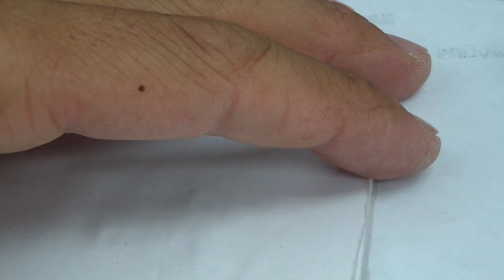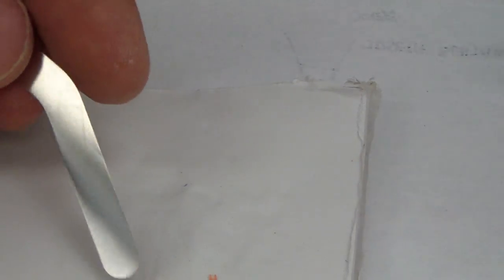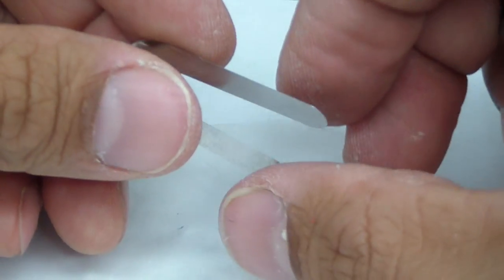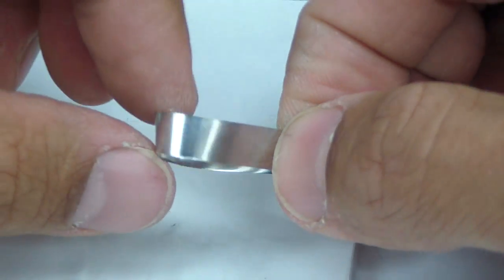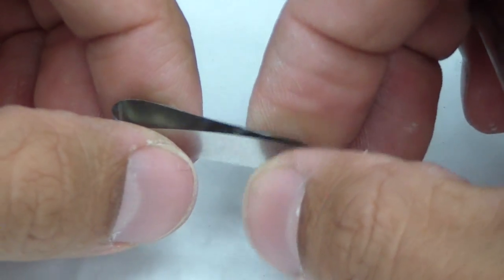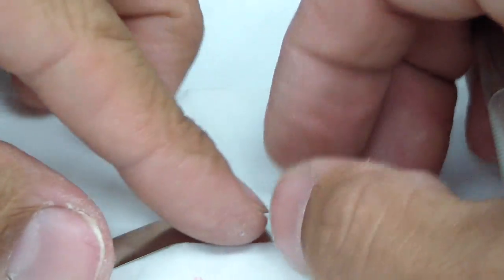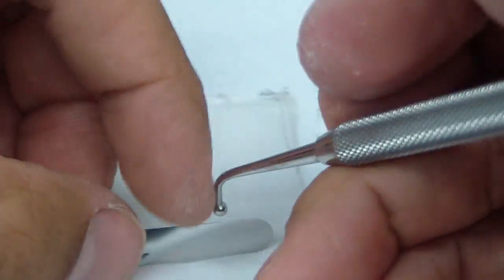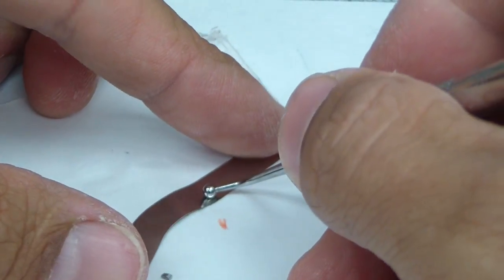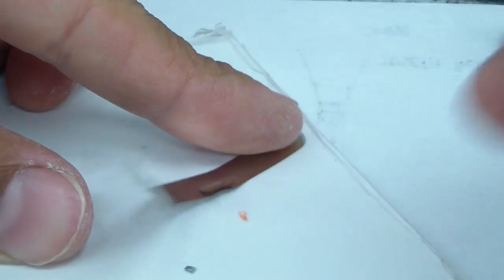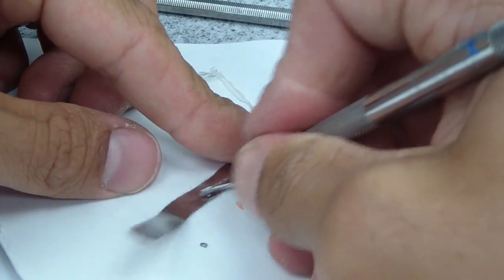So how do you do that? Well, it's very simple. You can take it, like I said, on a 2x2 mixing pad. It's going to take a little bit of practice if you haven't done it before. So if this is our Toffelmeyer, for example, and this is going to be our gingival portion right here. Let's pretend this is our buccal and this is our lingual, let's say we're going to do a mesial contact. You can mark it or just sort of shoot from the hip. Take a ball burnisher and you're just going to start burnishing it. It actually takes quite a bit of pressure.